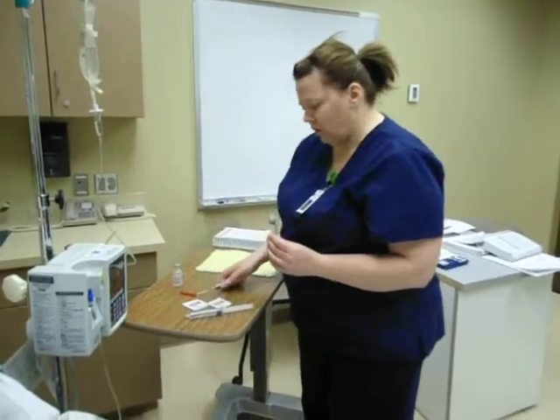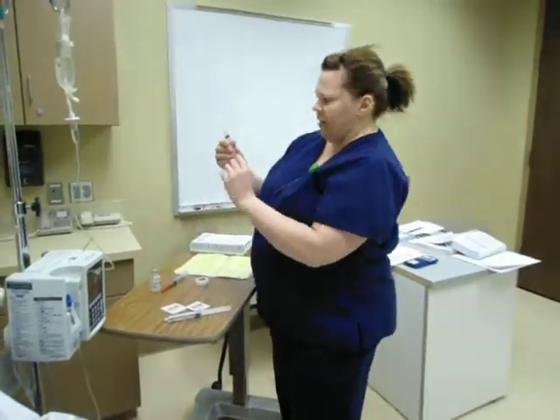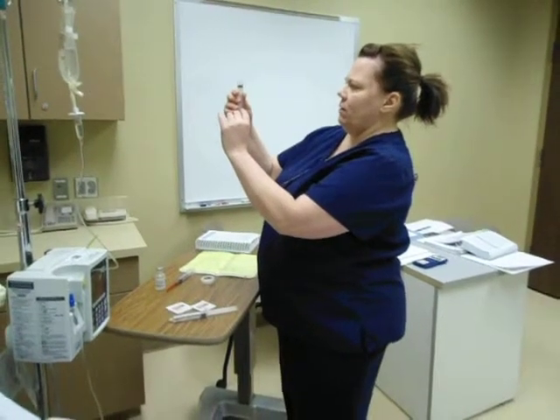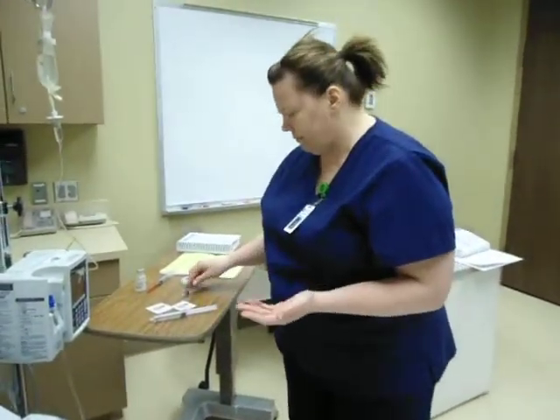This is going to go in the sharps container. I would not be recapping. For practice purposes, I'm going to recap it. And then I'm going to make sure I get all the air out. Okay. Now this would of course have a cap on it, but I don't have one.